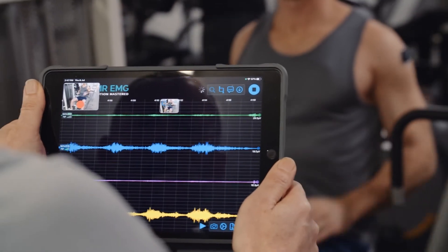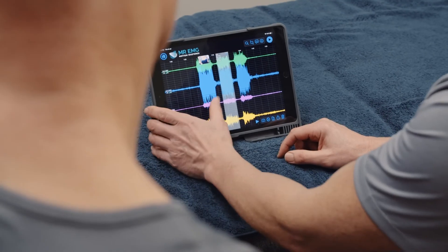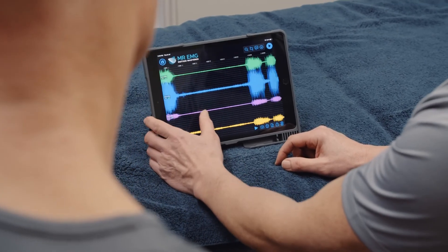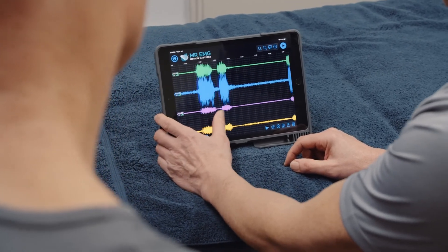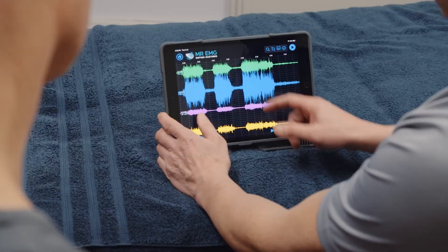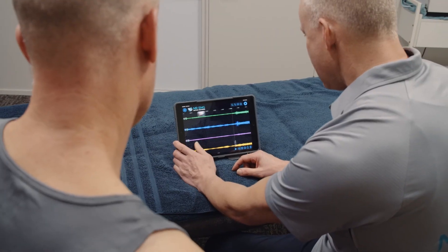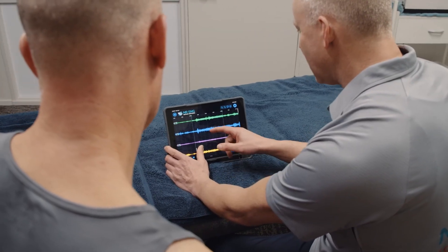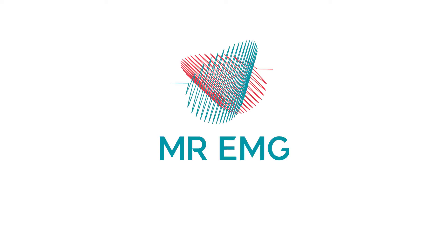To conclude the assessment, we recommend you sit down with your subject and analyze their data, identifying any muscle activity during movements you feel is related to their symptoms. We hope you enjoy using Mr EMG.